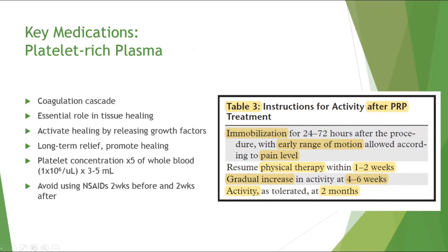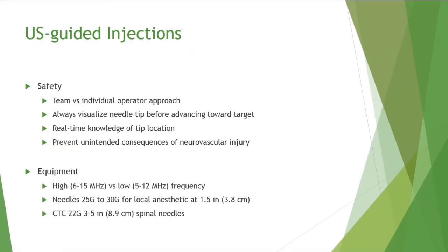So, well, some points to mention when we refer to ultrasound-guided injections is that safety is a prime matter. We can have a team working or an individual operator approach. So when we work as a team, we have to be sure that there is good coordination between the team members. If one is using the transducer and another one is using the needle, then there needs to be very good communication so as to avoid any type of mishap.